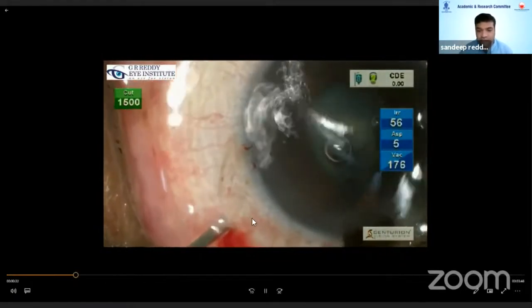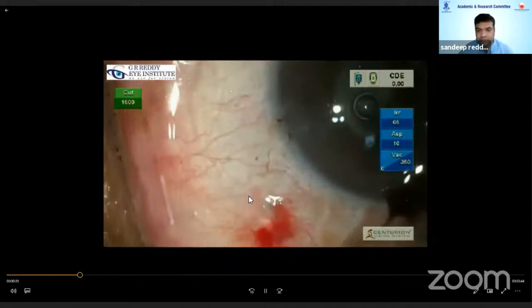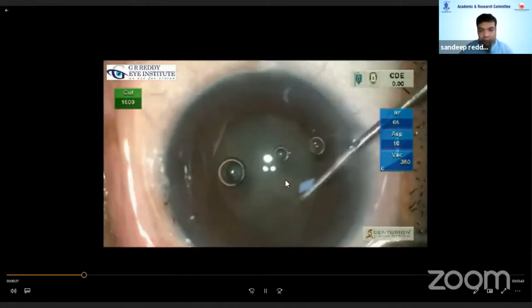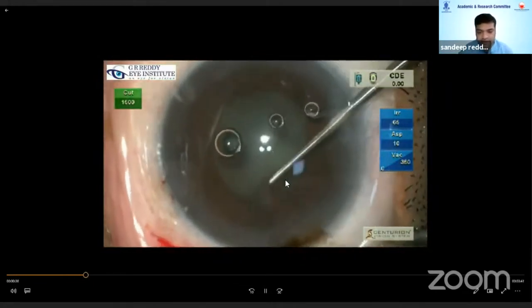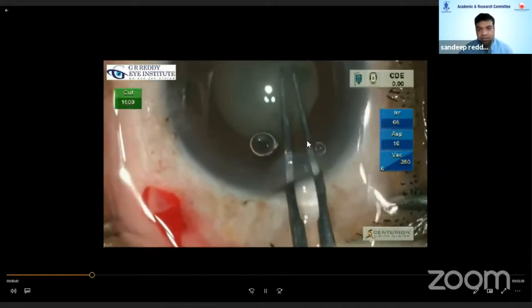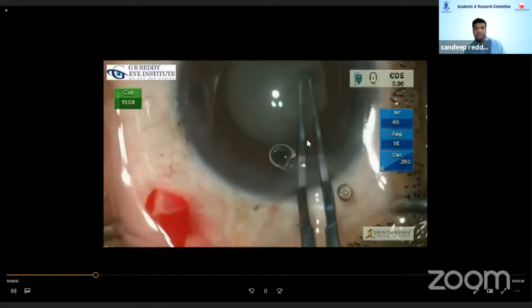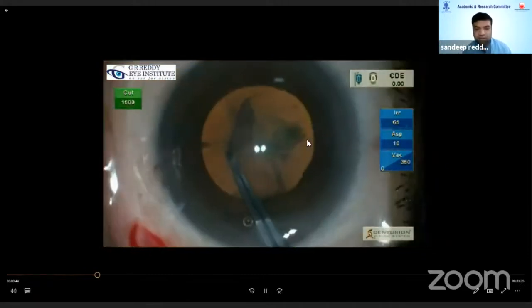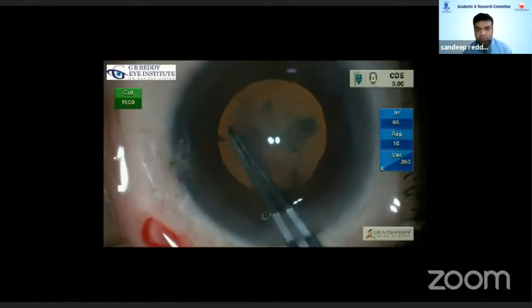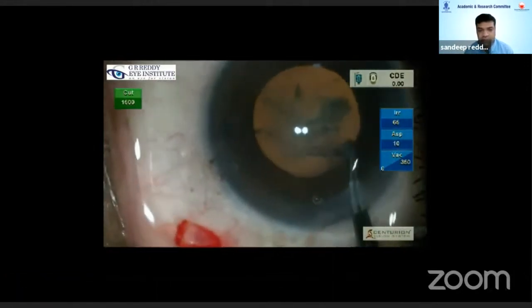What I did is I made a 23-gauge pars plana stab incision and did a mild dry vitrectomy. Once I did that, you can see I could manage the case as a regular case and go ahead with completing the surgery.